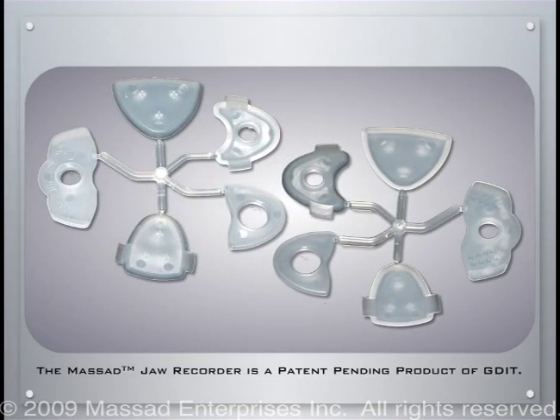We are now showing the jaw recording device delivered on the sprue. Simply twist off the appropriate sized part necessary to place both the striking plate and the pin receiver onto the base plate. Sizing is simply done, especially due to the fact that the recording device is easily adjusted with a dental lab burr.